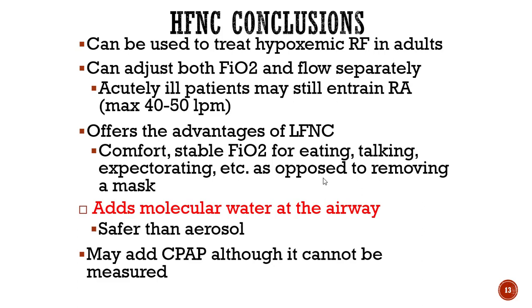It adds molecular water to the airway, so it's safer than an aerosol. The aerosol that we're talking about here specifically is the large volume jet neb. The reason that we always have to make that differentiation is that the heated humidity offered by the Passover heaters is molecular water. It does not have the same infection risk as the large volume jet neb, which delivers an aerosol or particulate water. And then another benefit is that it may add CPAP, although it can't be measured.